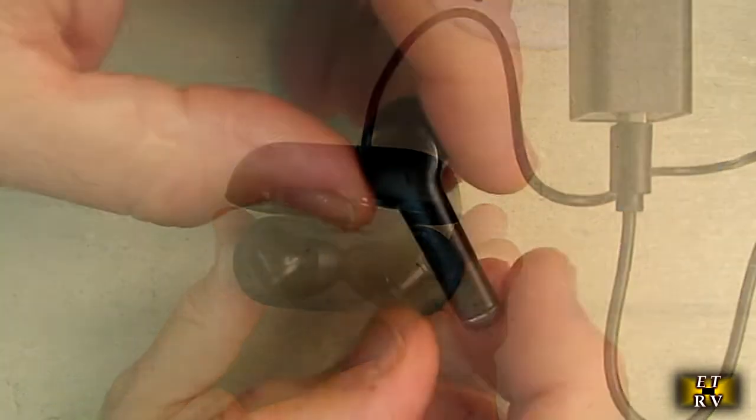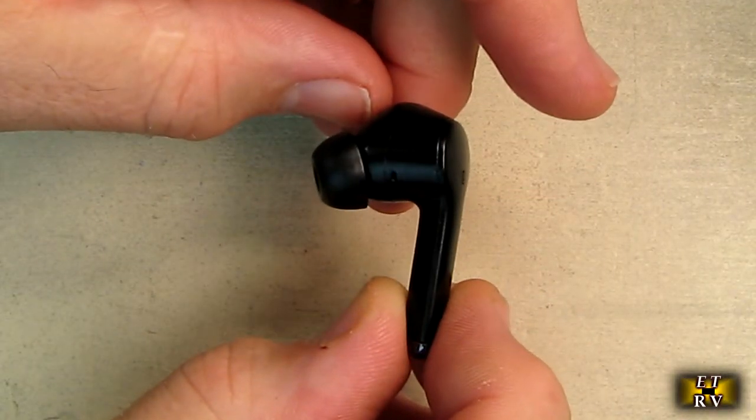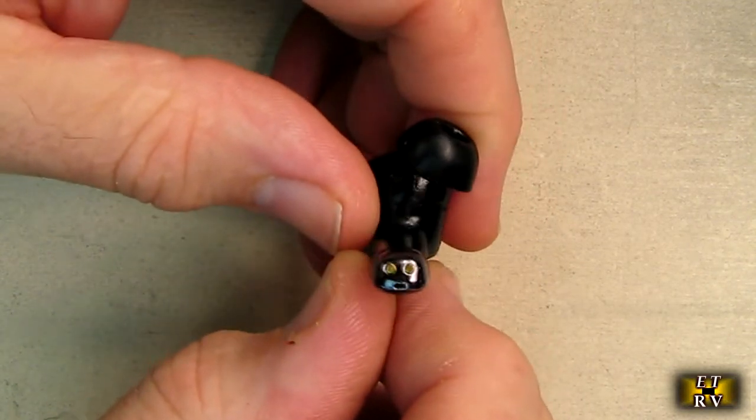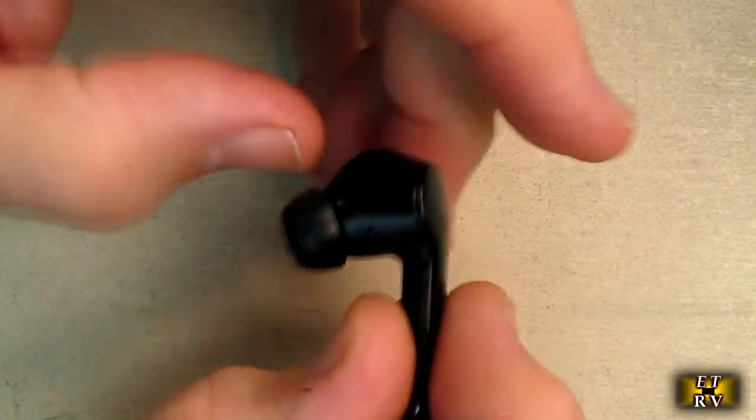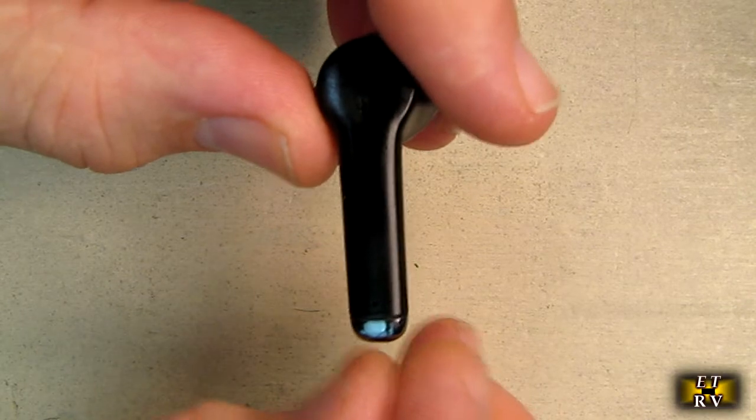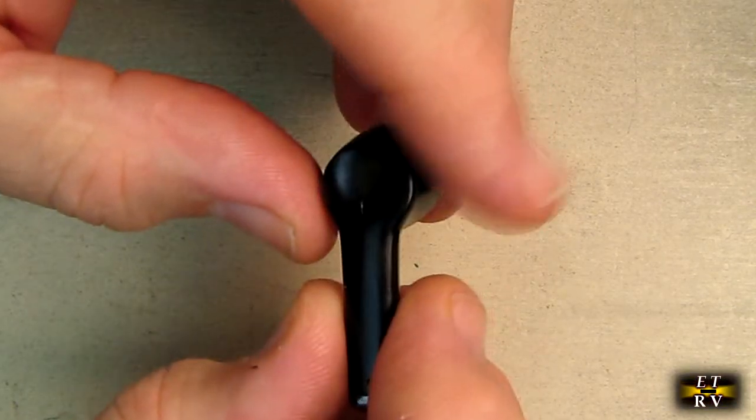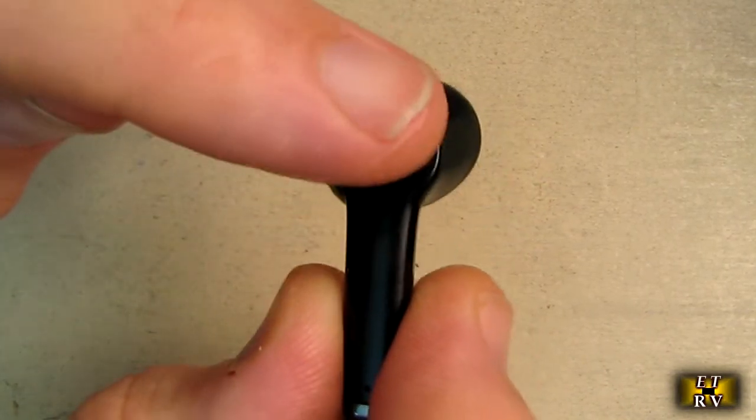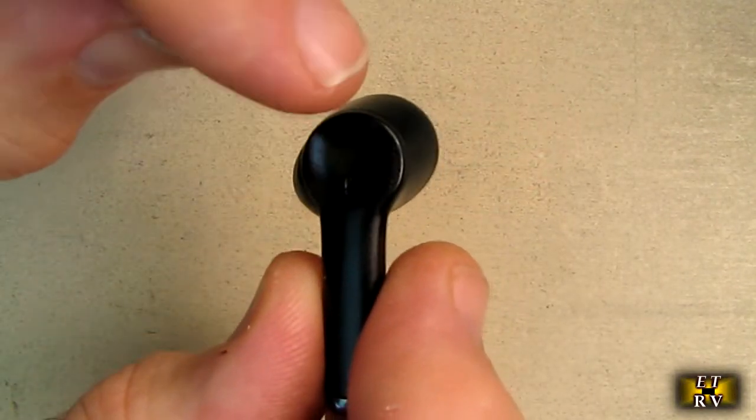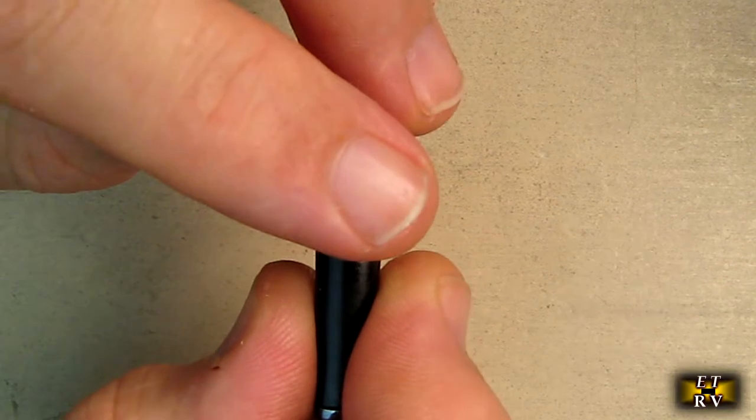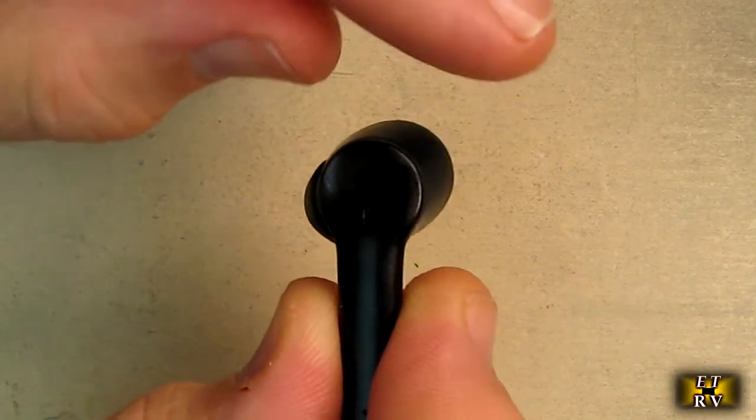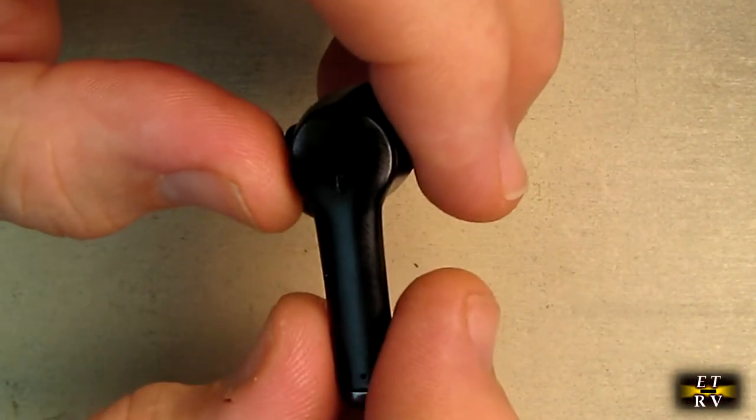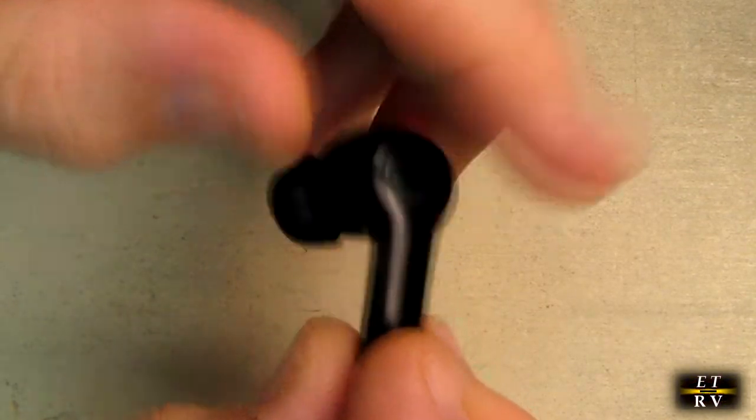Here's a close-up of the left earbud showing the bottom where the charging port is and the little status LED blinking right now. Here is the microphone—that little hole right there. If I touch that, you hear the sound. When putting this in, you want to avoid closing that or being near it because it'll get a feedback sound.